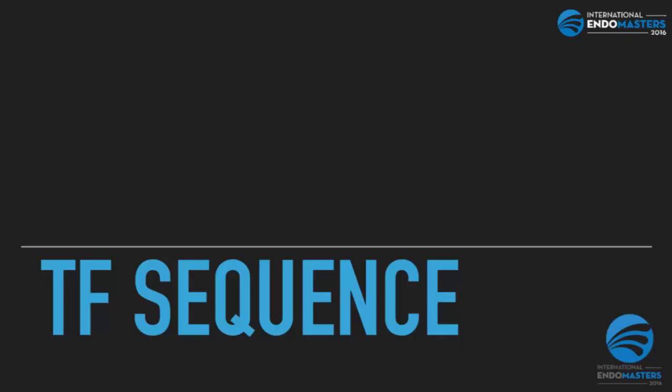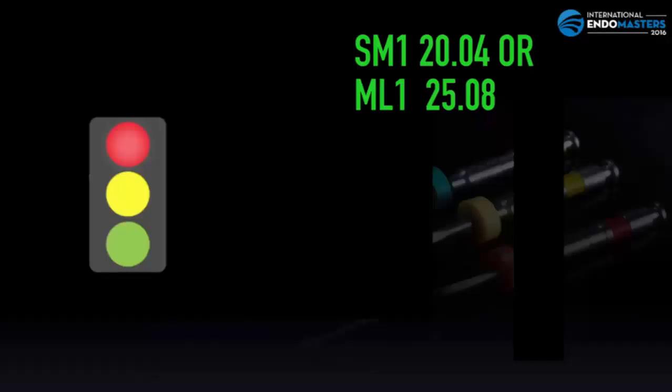Continue with our topic. We are going to talk about the sequence of the files. Contrary to all the ISO standardizations, the nomenclature of the TF adaptive files does not meet the ISO standardization. They are based on the colors of traffic lights.